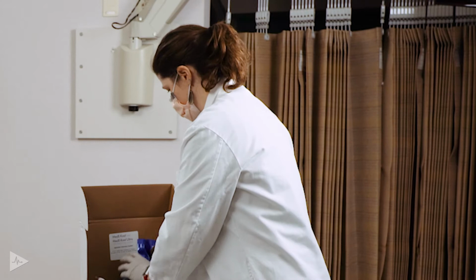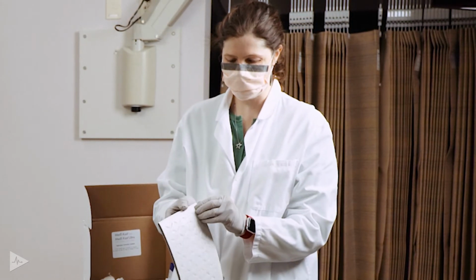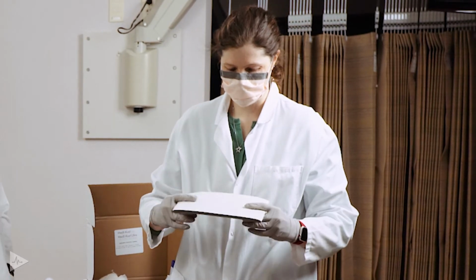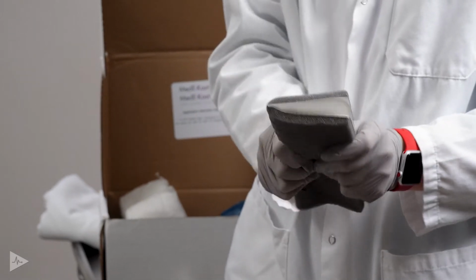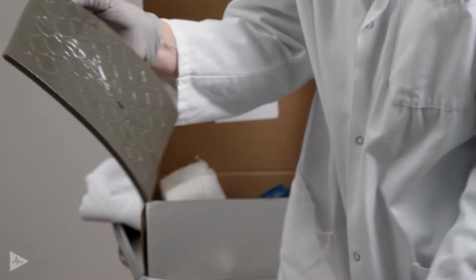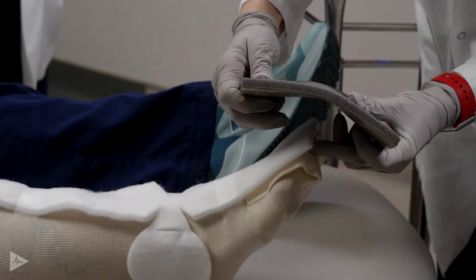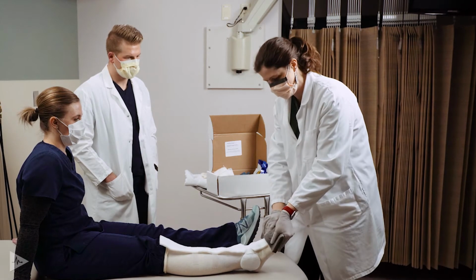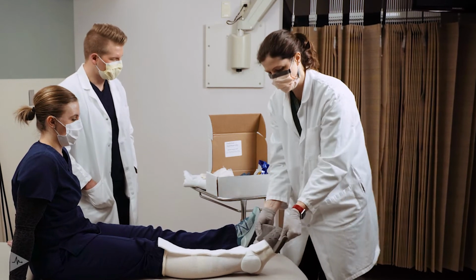We then have the foam layer for toe protection. This has a plastic backing and an adhesive on it. So we fold this in half. I like to pre-fold it before putting it near the patient's foot. And then peel that layer off, and we will fold this over the toes. And then squeeze the edges together, almost making like a pirate's hat.